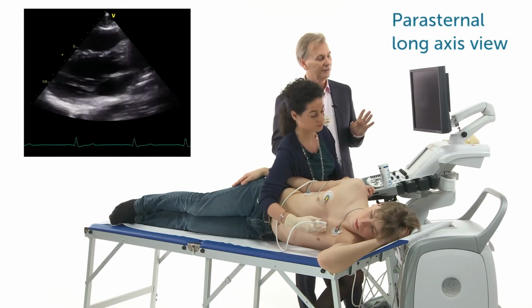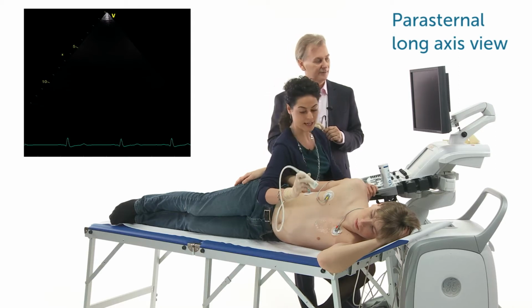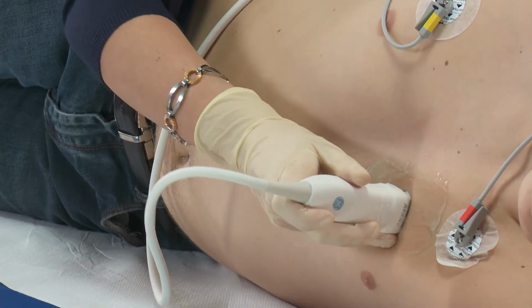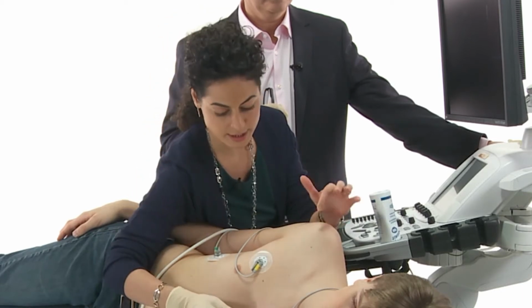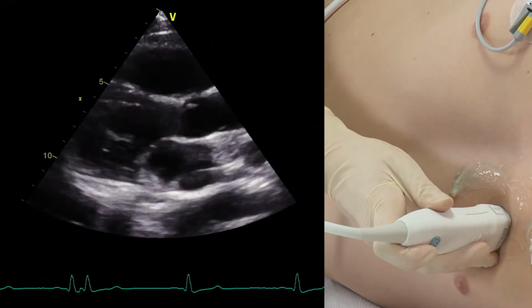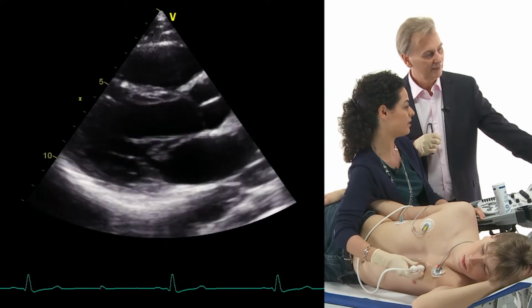Okay, Anna, stop. We have to show you exactly how to orient the transducer. Exactly. So again, the transducer goes around the second, third intercostal space, and the marker on the transducer is now pointing at the right shoulder of our patient. So simply playing around, we get in a few seconds a really amazing parasternal long axis view.